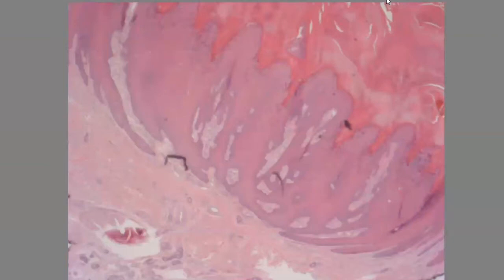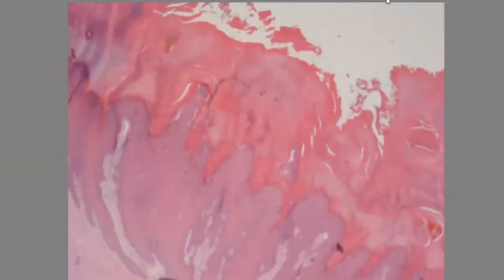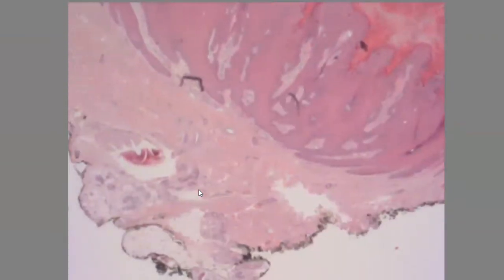So now we are at 2.5x. Let's first get some orientation about this slide. This is the top or surface of the skin, and this is the epidermis. This area is the epidermis with this hyperkeratosis on top, and then we will go deep, and this is the dermis.